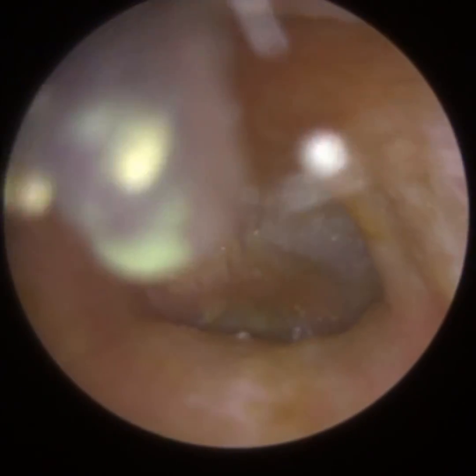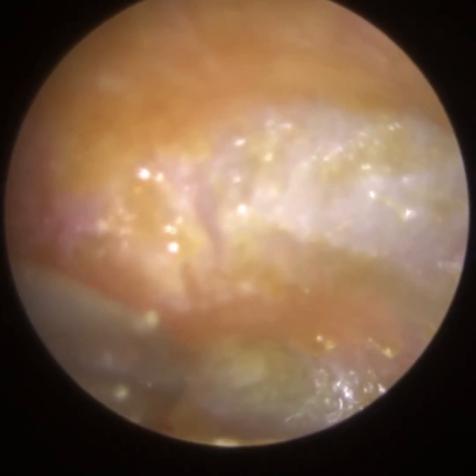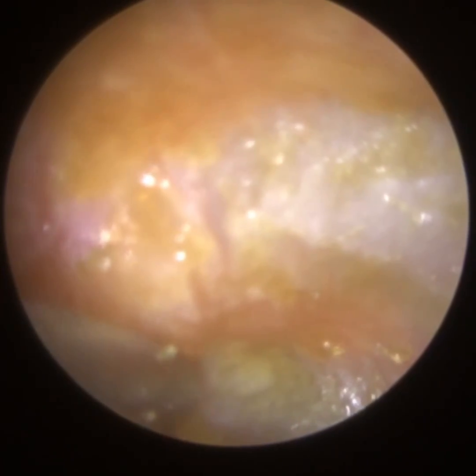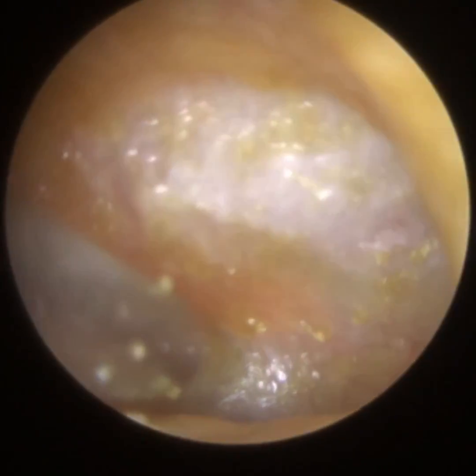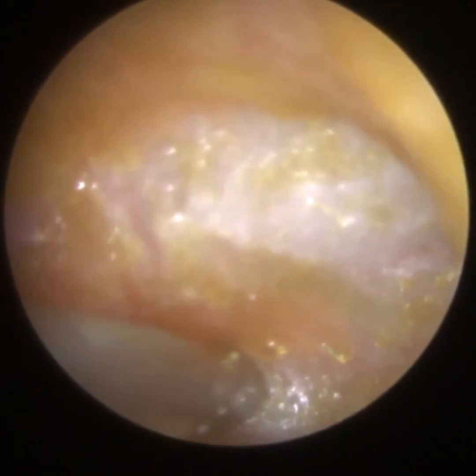So it's just a bit left anteriorly on the eardrum. Can just about squeeze the fine end in there. So we'll be really delicate here. So we want to avoid the canal wall to the left, but they've got the malleus, the hammer bone, which is coming up. You can see there the eardrum slightly moving, just trying to get it into that gap. The patient, this is all done under no anaesthesia. Patient's awake, comfortable throughout.